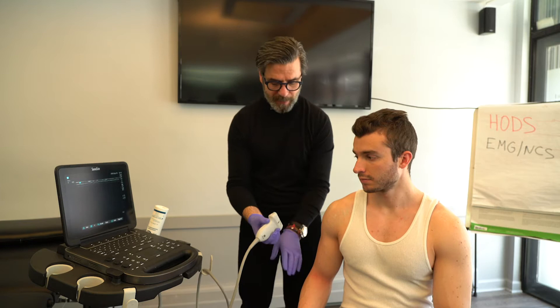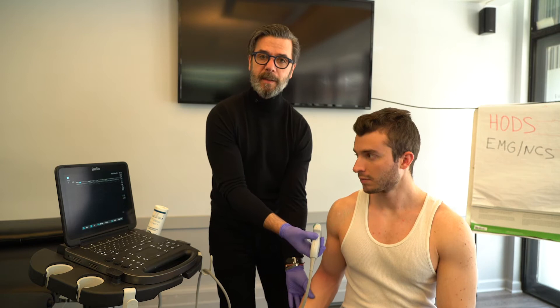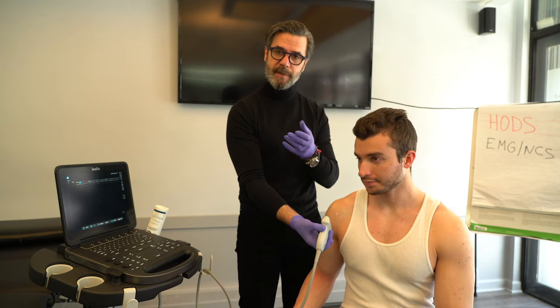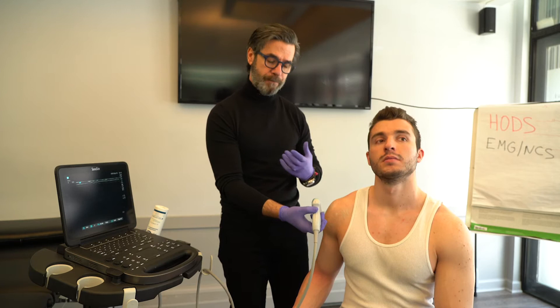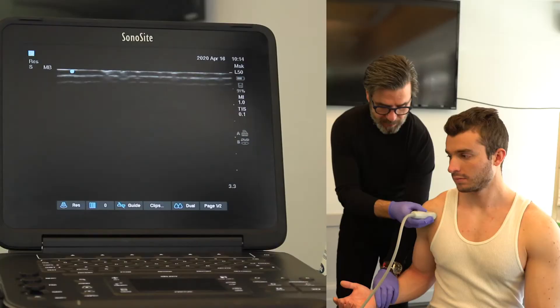The next part is the subscapularis, and this is the beauty of MSK ultrasound — it's dynamic. You can move the body part and see how the tissue behaves, which is something MRI cannot do since it's static. With MSK ultrasound, you can really see how tissue reacts and behaves with motion.